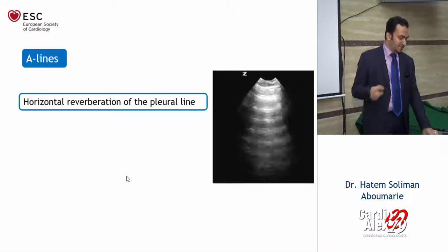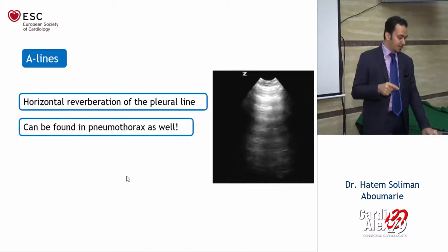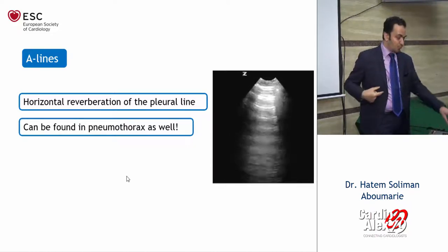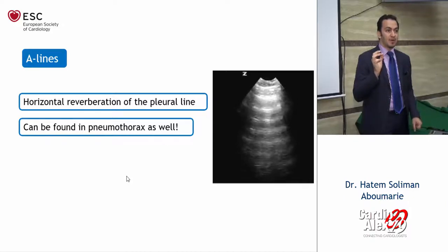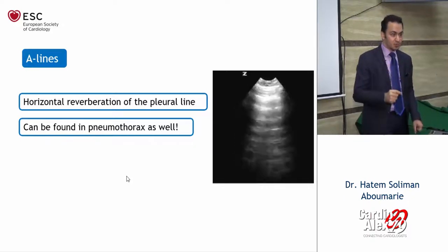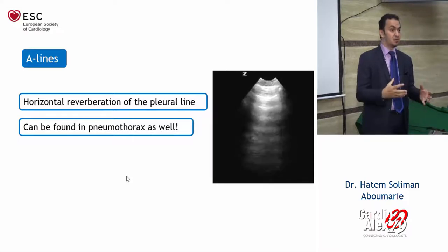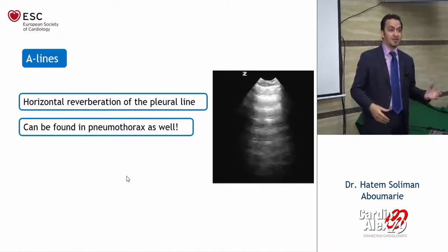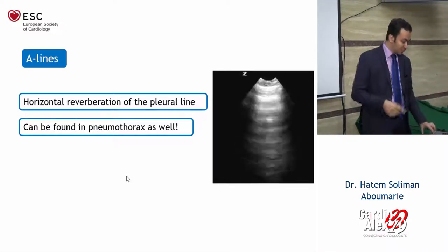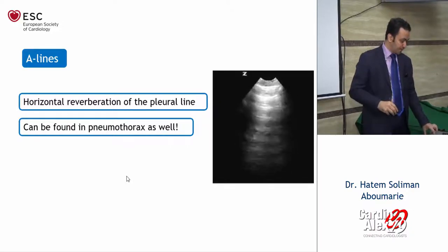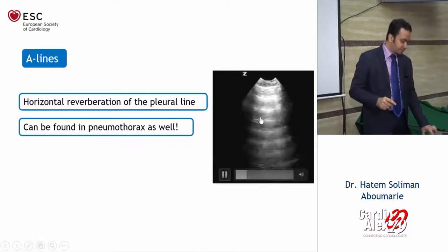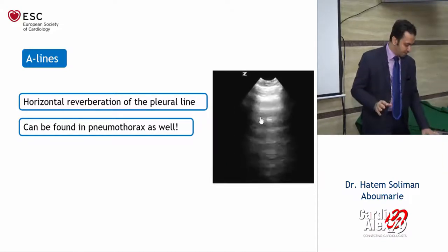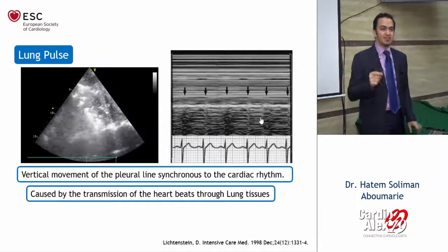Here is another example of A-lines using the cardiac probe. When we examine each sector and find A-lines, we can tell there is no pulmonary congestion or extravascular lung water — whether from hydrostatic pulmonary edema in heart failure or non-cardiogenic pulmonary edema like ARDS. A-lines must be at equal distance from each other; they are mirror-shaped artifacts in physics terms.